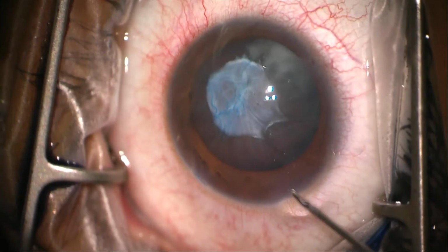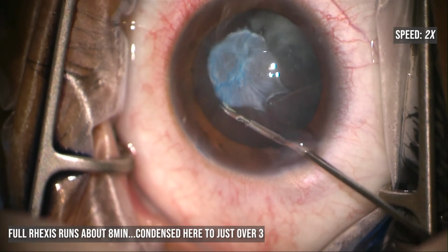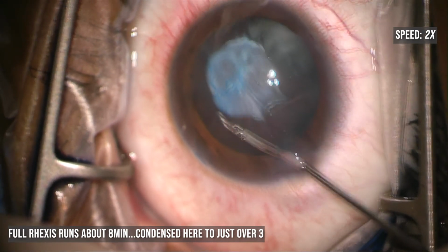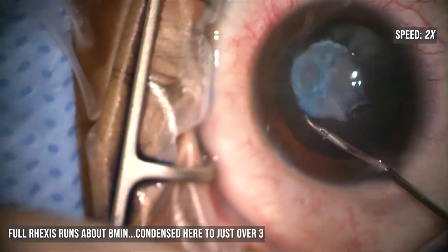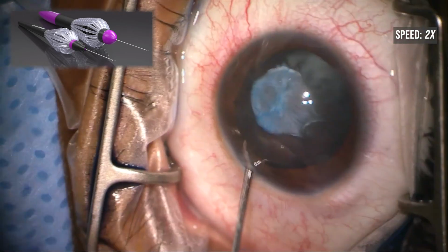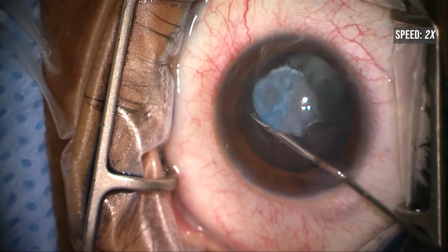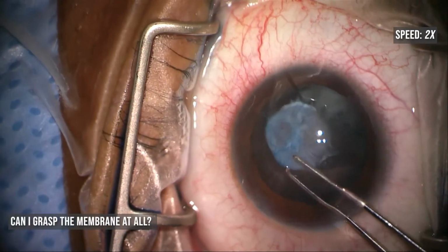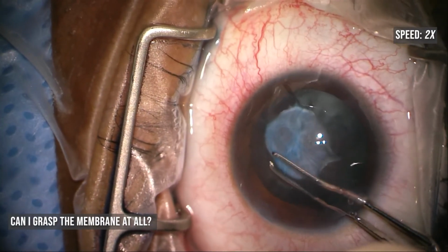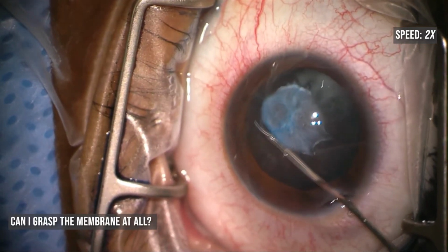So with that, let's go ahead and get into the next part of this surgery where we made the rhexis. This full capsulorhexis runs about 8 minutes, and I've collapsed it down to about 3. Most of the sections are running at twice natural speed with all of the extraneous going in and out and thought processes cut out. And here we've really run the capsulorhexis around a bit, and now I want to see whether it's loose or whether I can grasp the membrane or the capsule, and it didn't work.